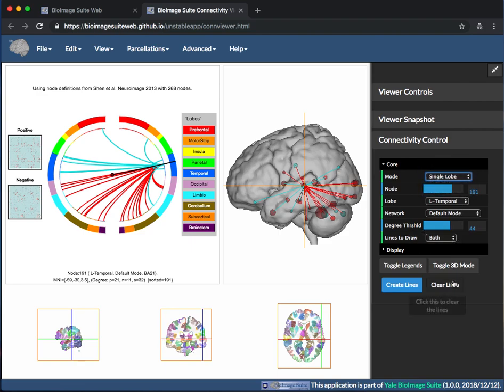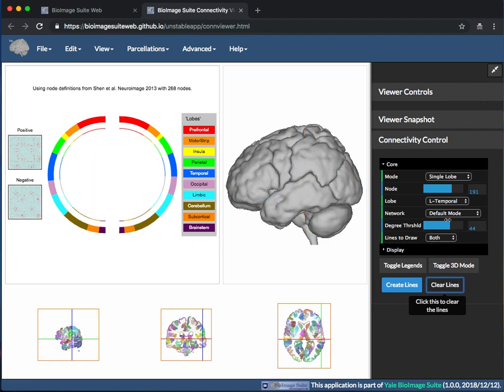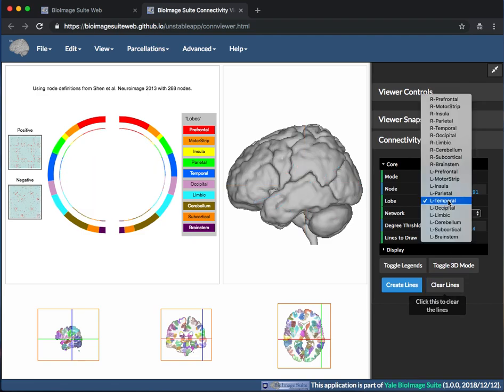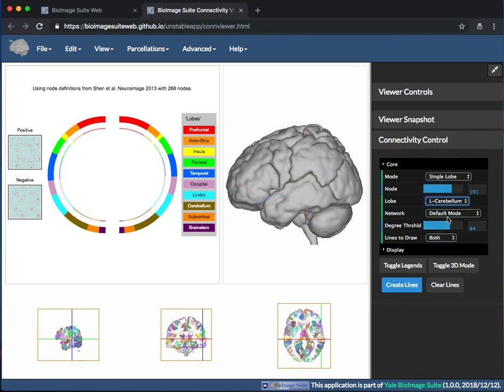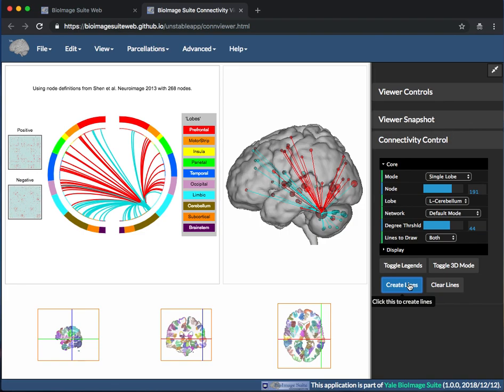First, clear the original lines, then choose Lobe, left Cerebellum, change the Degree Threshold, and click Create Lines.